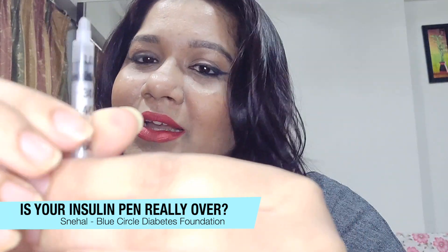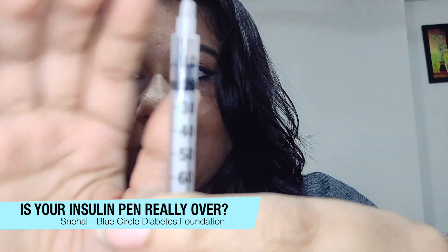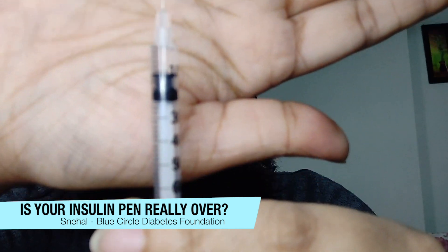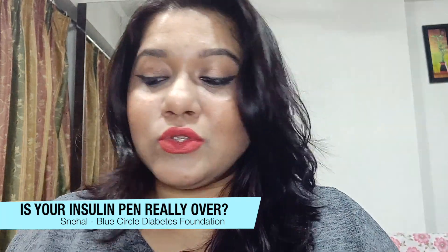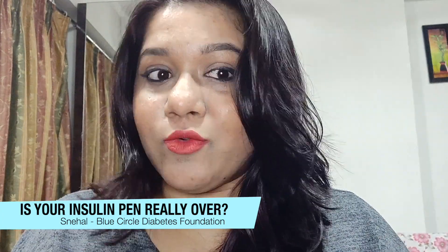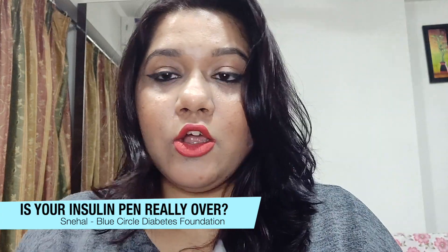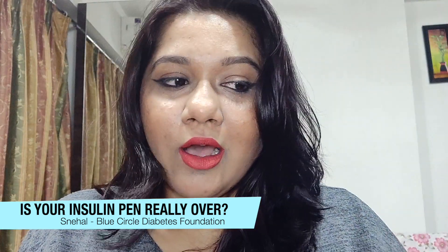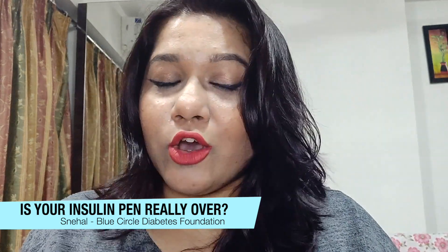I've completely removed the air bubbles from the syringe, and if you look closely, I have about 10 to 11 units of insulin — which is good enough to cover one meal. So from a cartridge that was apparently empty and not working in the pen, I used an orange-capped 100 IU syringe to pull the insulin out and managed to get around 10 units. That's our hack — a little trick to use your cartridge to the fullest.